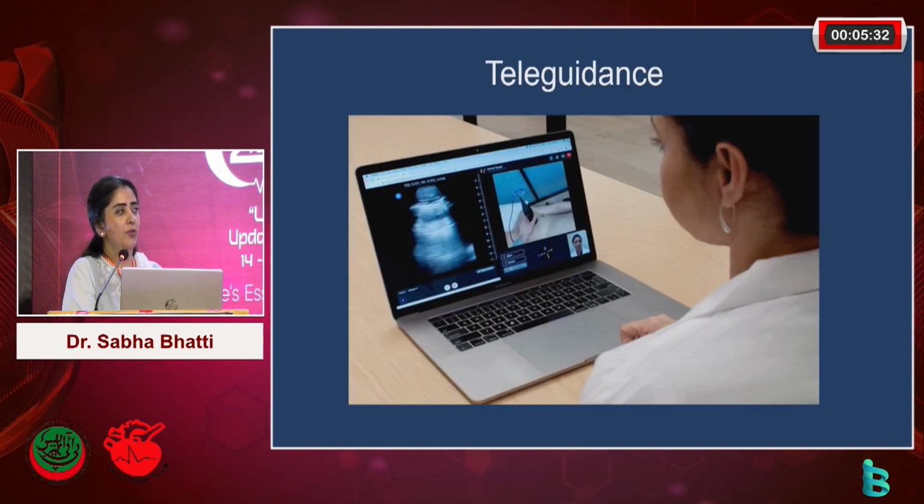And then what you're able to do then, and we've done this, through one of my remote sites that has a Butterfly, so this is not a picture of me, but basically on a laptop, I'm able to look at the images here that are being acquired by this echo tech, who is sitting in any of our satellites in Larkana or Sukkur or across the road in the Jinnah OB clinic.